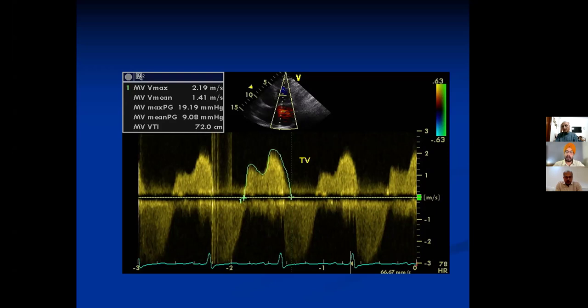Sir, I think you're absolutely right, because PHT is only reserved for rheumatic mitral stenosis. It cannot be used in the tricuspid valve, and not even in a mitral valve prosthesis. Same limitation, yes.